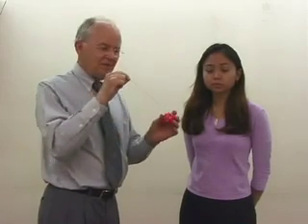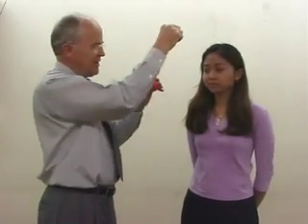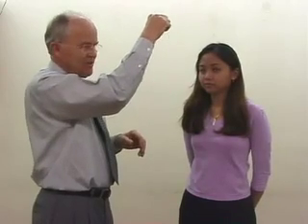Between takes, Nora asked a good question about the use of the small handheld ball versus the one hanging from the ceiling. And I'd like to answer that now. I'd like to have this little handheld ball chair side. It's real handy for one thing. It also moves faster and will elicit symptoms more quickly and more instantly, I think, sometimes, than the one overhead. So that's why I like to use this.